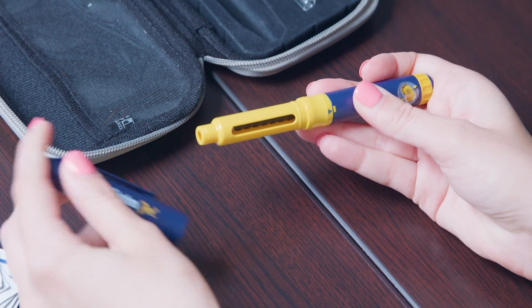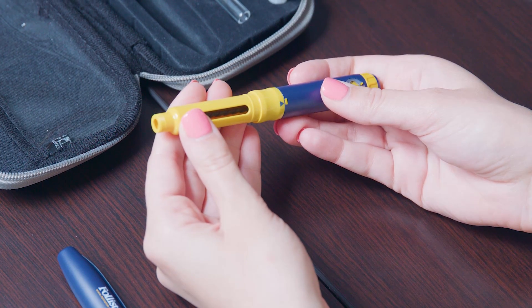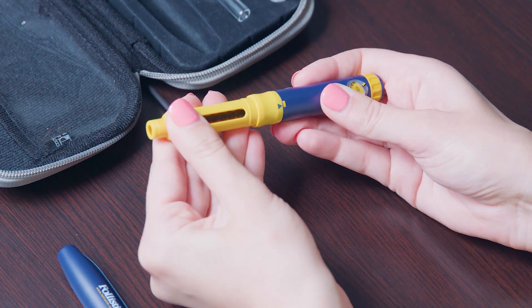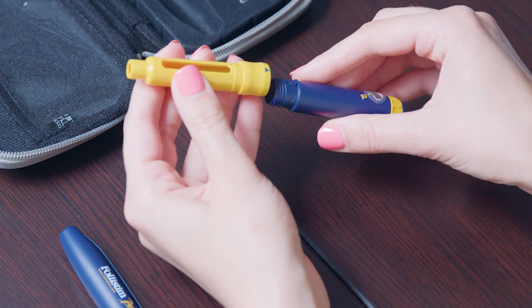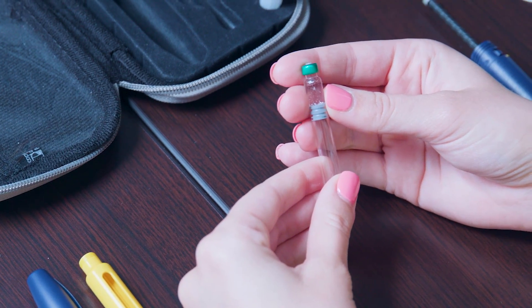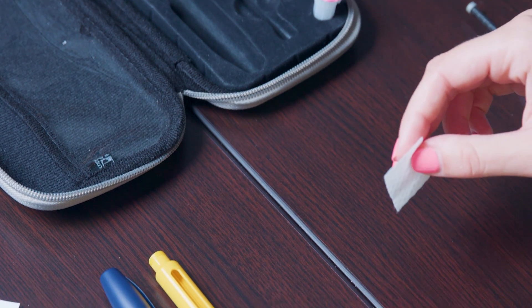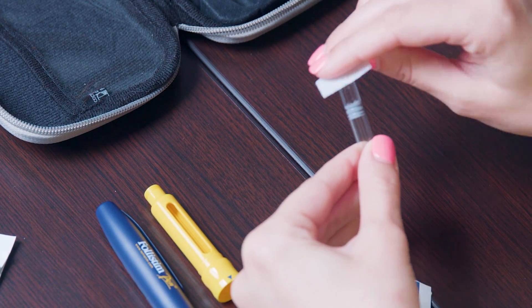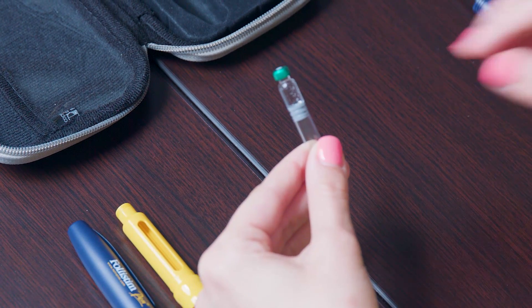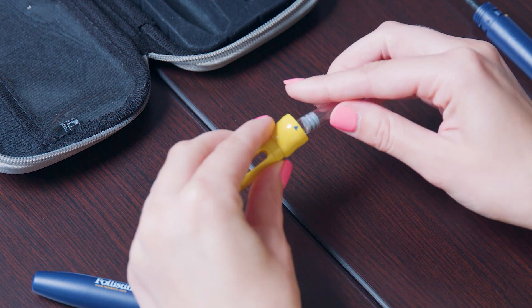Hold the Follistim pen and remove the blue cap portion of the pen and place it off to the side. Separate the blue and yellow sections from each other by unscrewing them and set them down on the counter. Pick up the Follistim AQ cartridge, making sure the liquid is clear with nothing floating in it. Disinfect the rubber stopper at the metal cap by wiping it with an alcohol swab. Now hold the yellow section of the pen in your hand and place the Follistim AQ cartridge into the pen with the metal rim going in first.